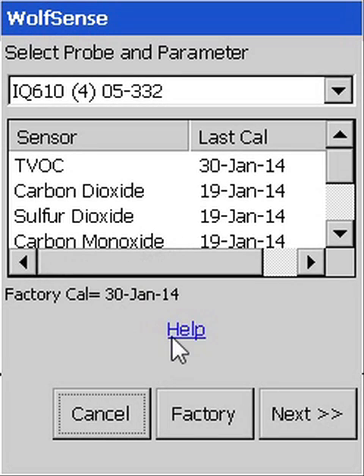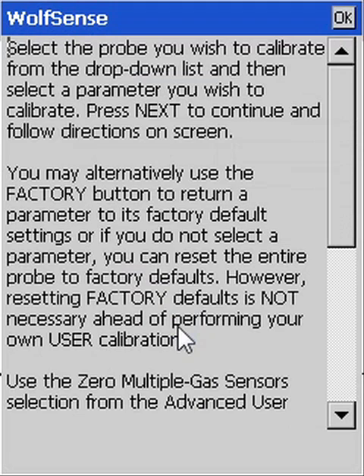Selecting Help provides more information, including how to revert to the underlying factory calibration if you are concerned that a user calibration wasn't performed properly. You don't have to be afraid that you might mess up the calibration.